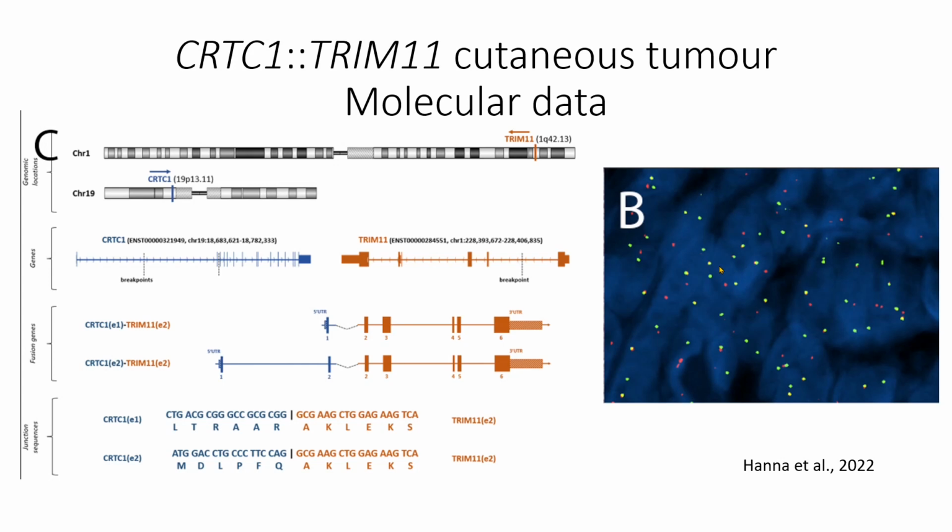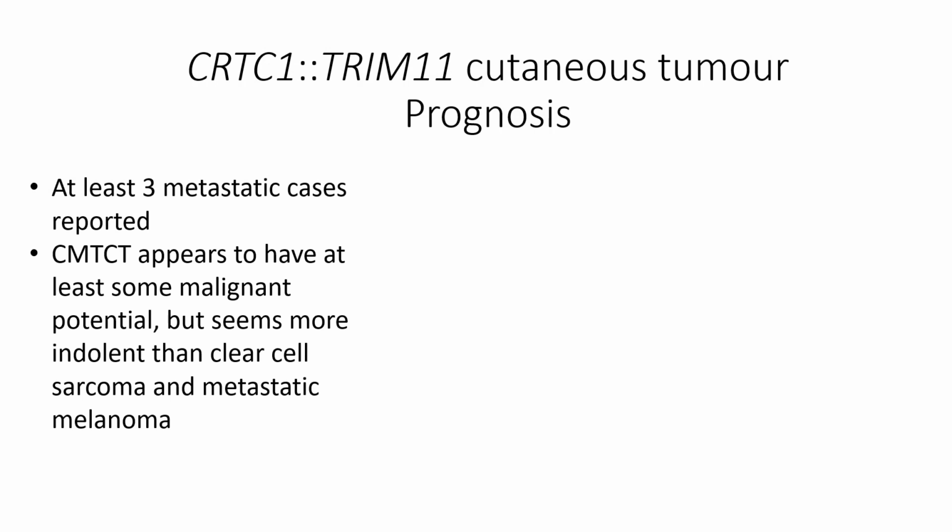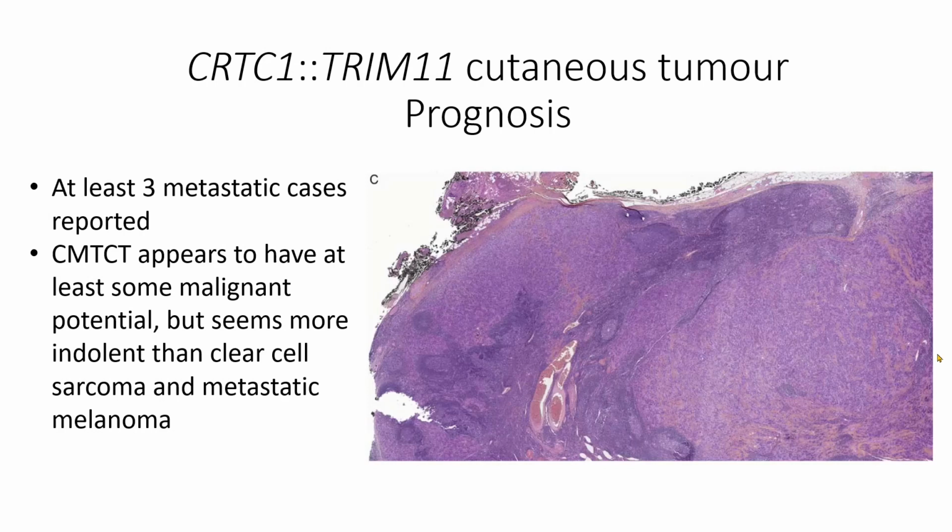Regarding the prognosis of such tumors, there have been several metastatic cases that have been reported, and globally it seems to have some malignant potential, but seems less aggressive than clear cell sarcomas or metastatic melanomas. So here's an example. You see the invasion of the lymph node.